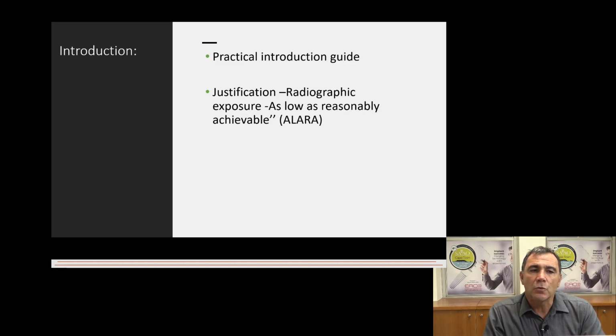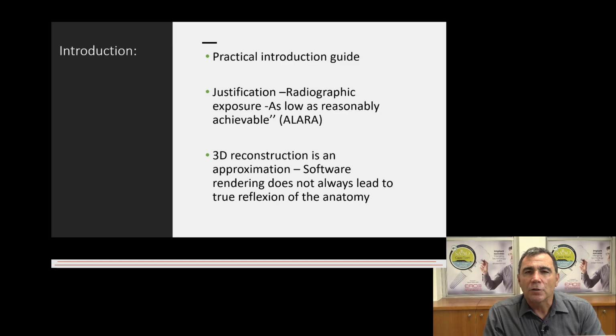Before you make that judgment of that CBCT, we must adhere to the ALARA principle. And the 3D reconstruction, you must also remember, is a reconstruction. It is cuts in the axial format, and those are reformatted to form a 3D image. The newer technology and the newer computer software is so good that we would hardly notice a mistake, and with artifacts being diminished by software. But remember, it is software.